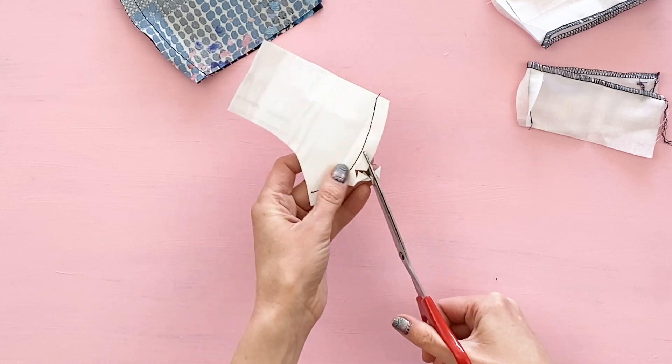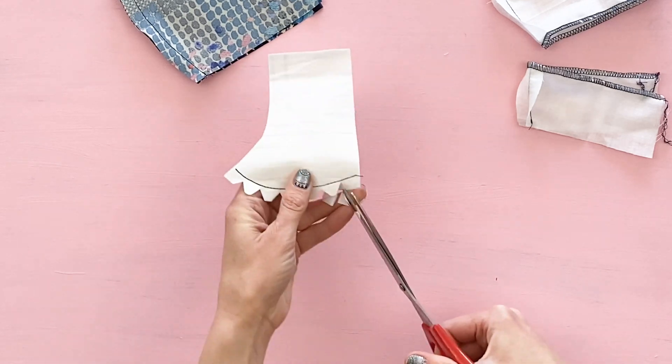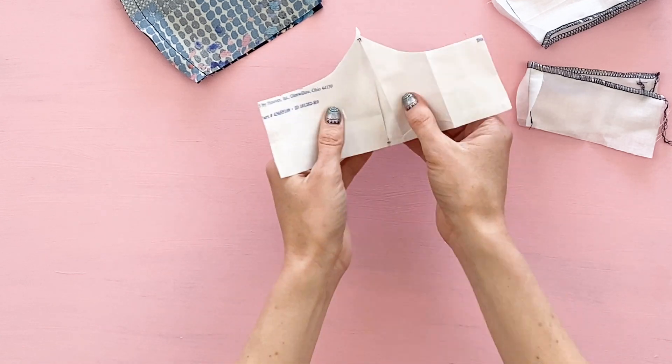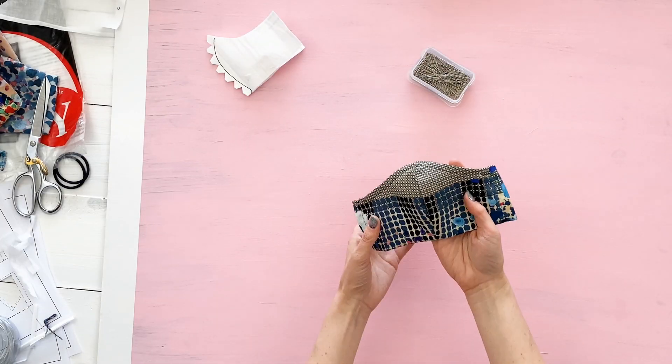Once your filter is sewn, we're going to cut tiny notches into the seam allowance, making sure you don't cut into your stitch line. These little triangular shapes cut out will make your filter expand and contract around your face a lot easier.